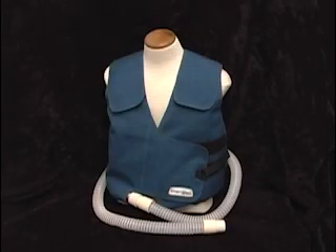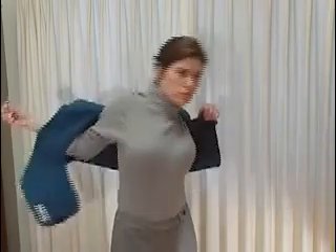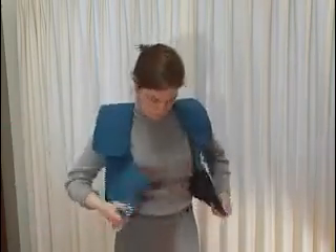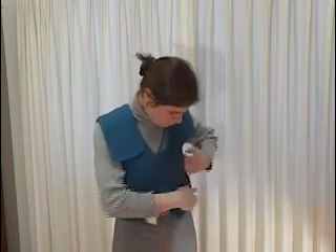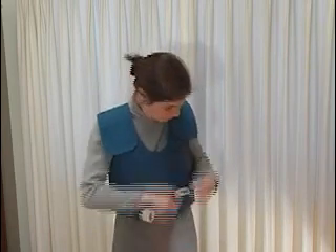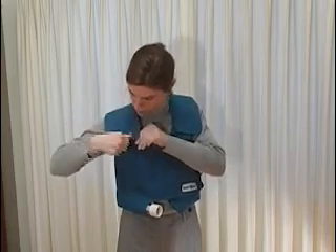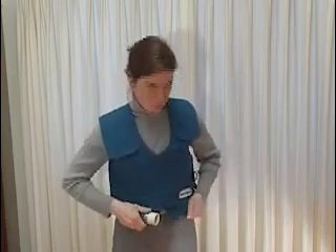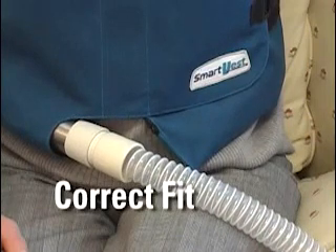Because the air pulses are delivered to the torso through your vest, it is very important to fit it correctly. Wear a single layer of clothing, such as a t-shirt. Put your vest on. The tummy flap should be adjusted so the SmartVest fits snugly, but not to the point where it restricts breathing. Adjust the shoulder straps so that the bottom of your vest is at your waist, or slightly below it. It should also be high enough so that it does not fold at your lap while you are sitting.